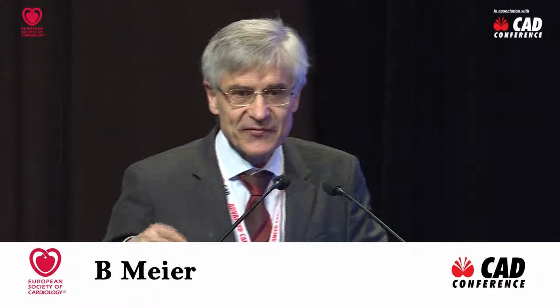covered the field quite well, and I'm going to basically corroborate what he's going to say, but let me just give you this example here. What would you do with this left main lesion that you can see up here? You see that 1929, you probably say the patient's too old for bypass surgery anyhow, so go for PCI.